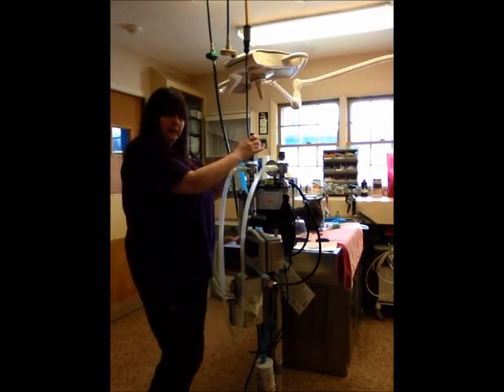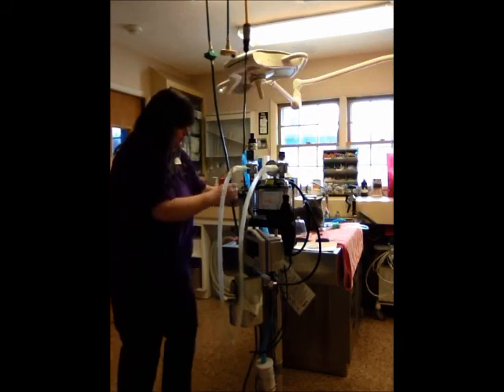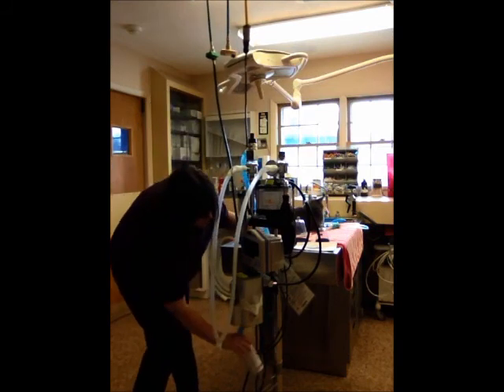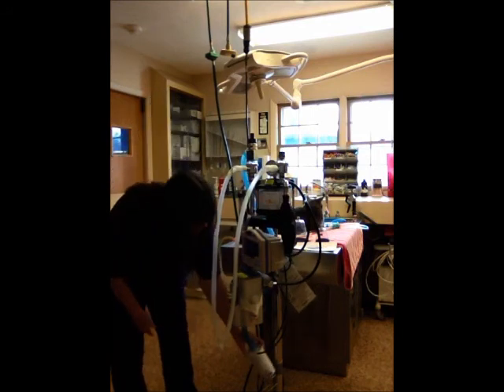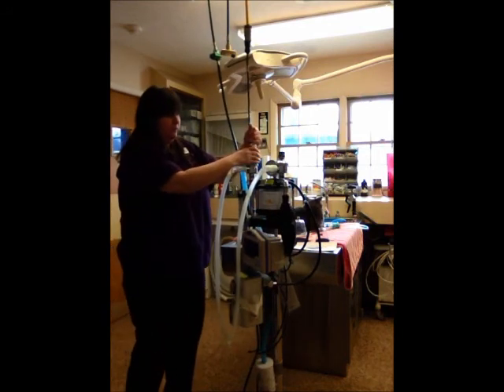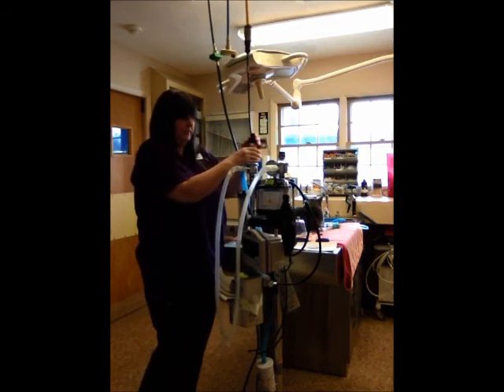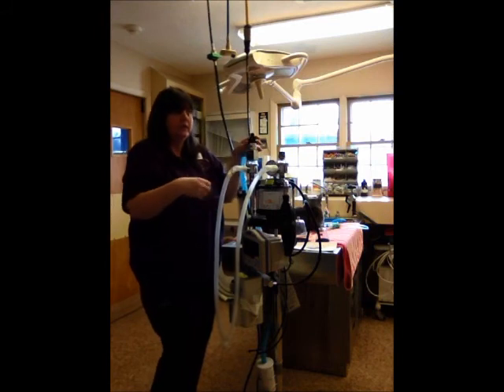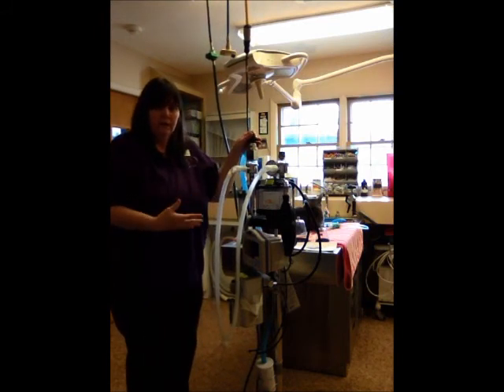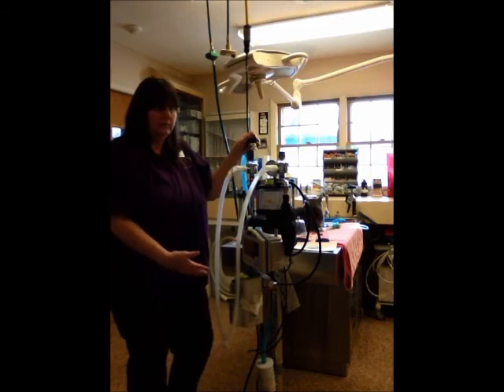Another portion of the waste anesthetic gas will leave through the relief exhaust valve and enter into our anesthesia absorbing canister. By some of the waste anesthetic gas leaving through the relief exhaust valve, it allows the machine and the lungs to maintain equal pressure of 1 to 3 centimeters of water.